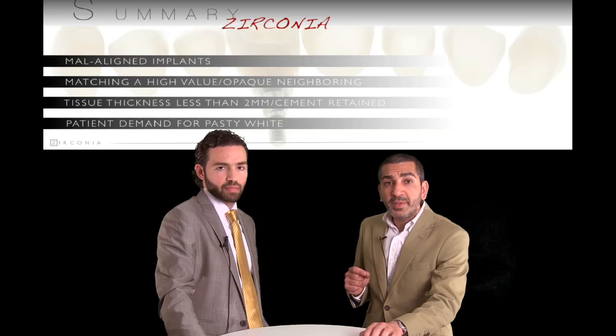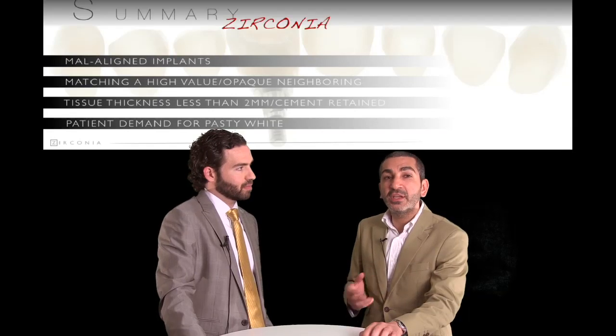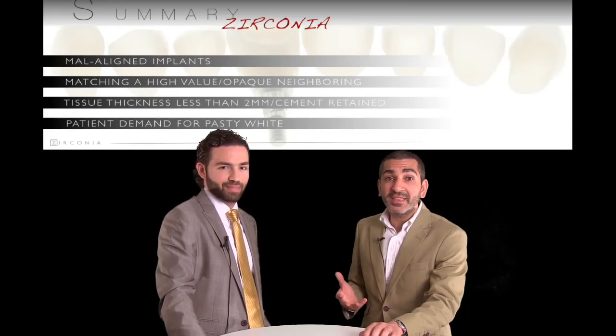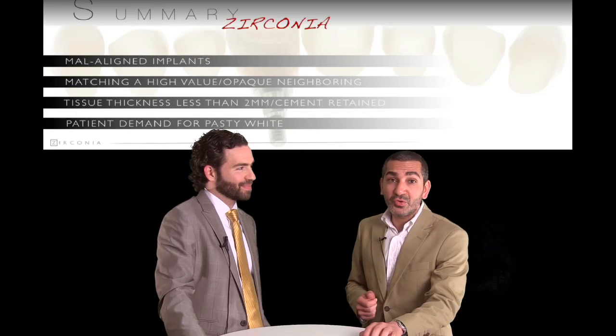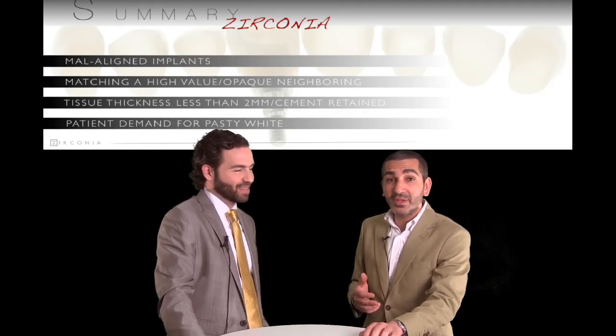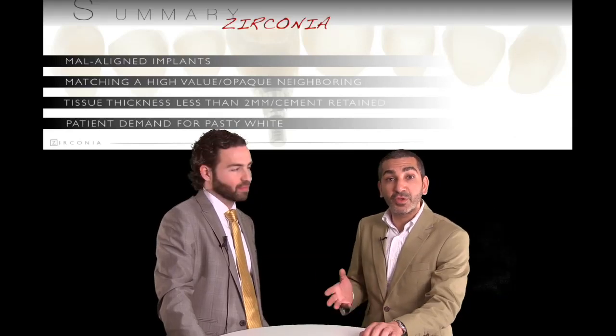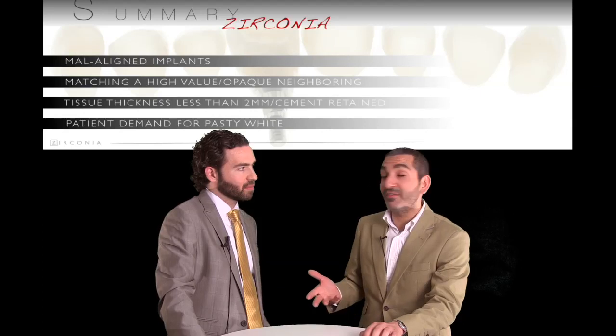And we have particular instances when the patient will come in and they will ask for these pasty white looking restorations. We get that a lot in Southern California. I'm sure it's going to start spreading across the world. And if that's the case, zirconia will definitely be able to give those types of opaque looking restorations for you. So in that regard, it can be an advantage.